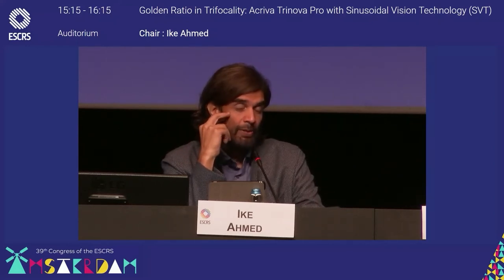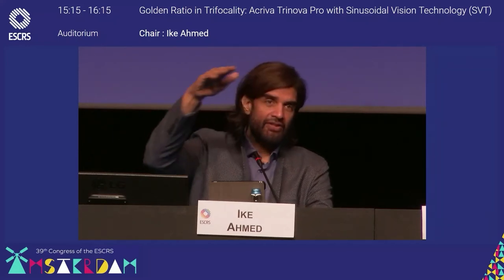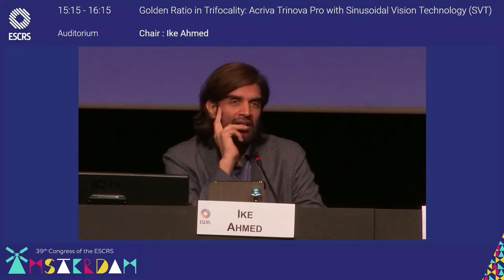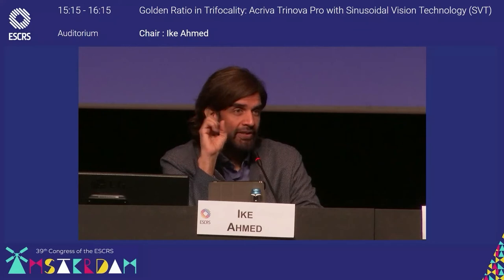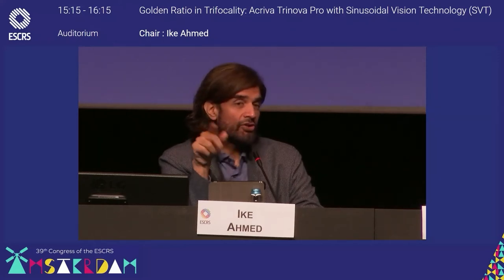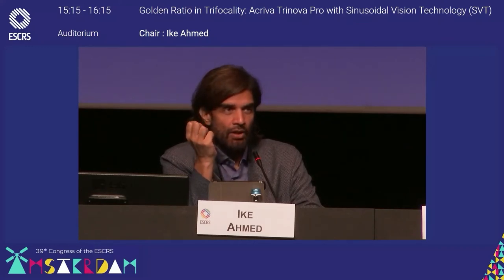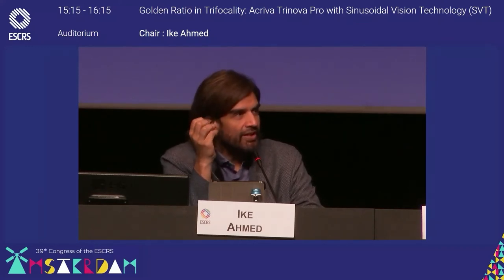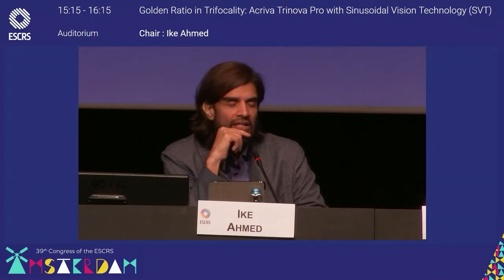Also the pupil adaptiveness has changed. Before, we basically had the same amounts at different pupil sizes, but now we see this change from intermediate to near depending on pupil size. So that's the pupil adapted nature of it. Those are some of the differences. There might be some other things as well, but I think those are some exciting differences between the two. I should also add that I'm aware a new injector is coming through. I think that'll be something we all look forward to. Injectors are not the first thing we think about, but obviously when you're in the OR, you want something to go smooth. So it's nice to have that.